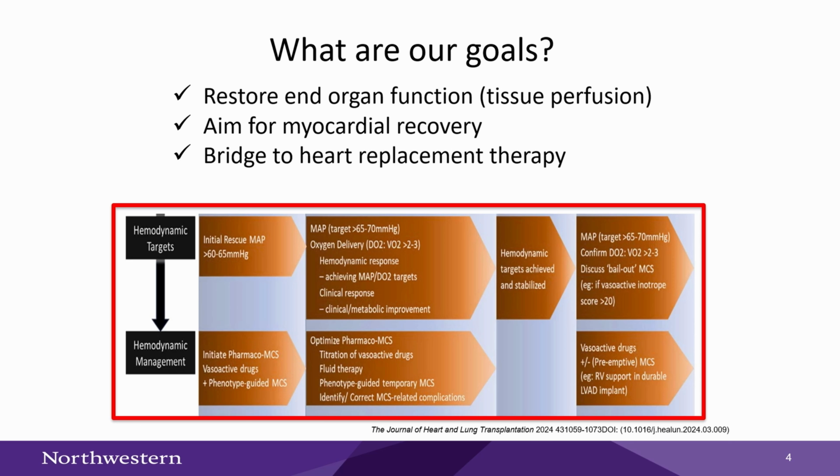And if you notice, in our first goal there's no SWAN number in here, there's no EF in here, right? So our first goal is a clinical goal. It's not a SWAN goal. And as I'm talking about the use of SWANs and echoes, I might say like 4 different times that this really has to be put into the context of everything else. And I think Jason said that earlier today as well.